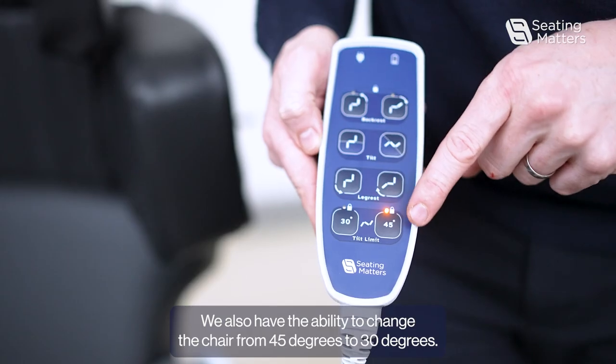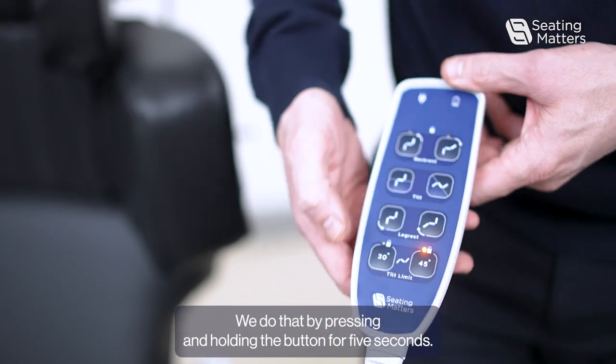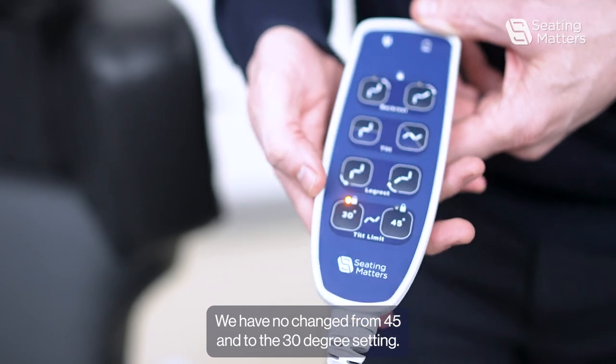We also have the ability to change the chair from 45 degrees to 30 degrees. We do that by pressing and holding the button for 5 seconds. We have now changed from the 45 to the 30 degree setting.